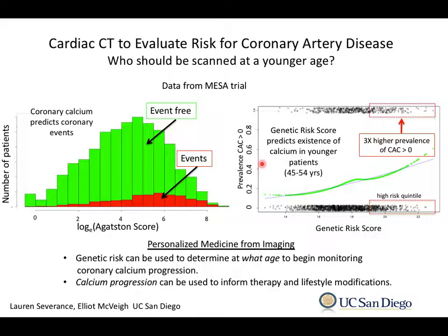So it's all statistics basically. If you look at the Agatston score, this guy, I don't know what his first name is, Agatston. He came up with this calcium score on a napkin in a restaurant, right? So it's not a terribly well-engineered score, but it's sort of like a logarithmic transform of the amount of calcium that's detected on a scan. And then when you take the log of that score, actually, you get statistics that look like this, where the folks in red, this is the log of their calcium score.